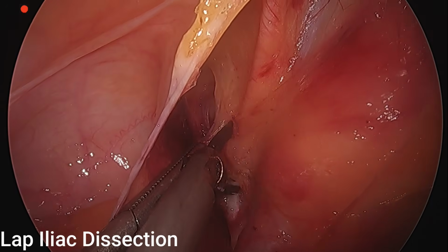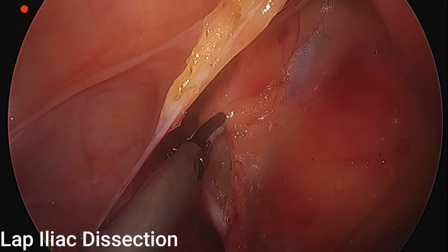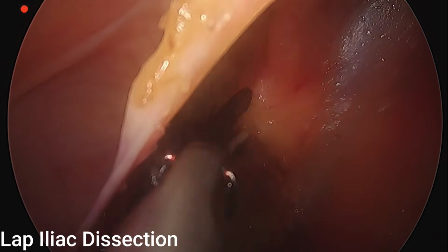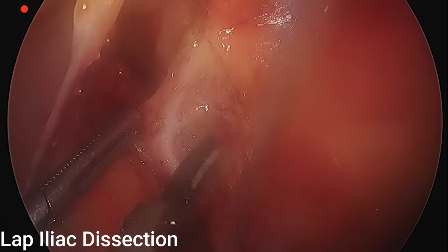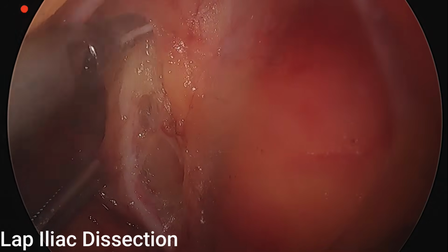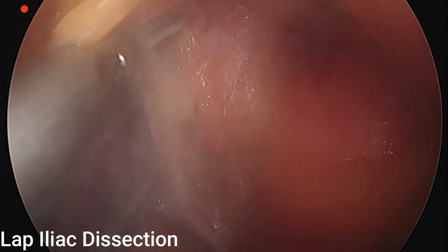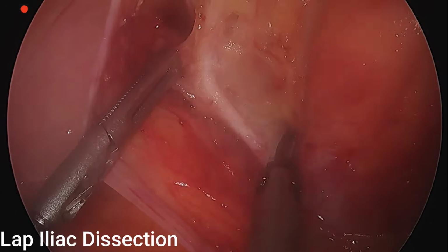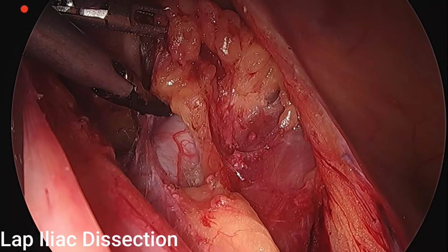Now we turn our attention towards the internal iliac artery, which continues as the obliterated umbilical ligament distally. So the internal iliac artery is completely exposed and all the fibrofatty tissue is lateralized again, and the internal iliac artery is medialized. You can see the posterior branch of the internal iliac vessels there. So it is completely exposed from proximal to distal.